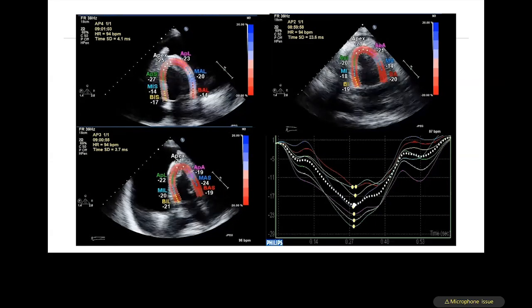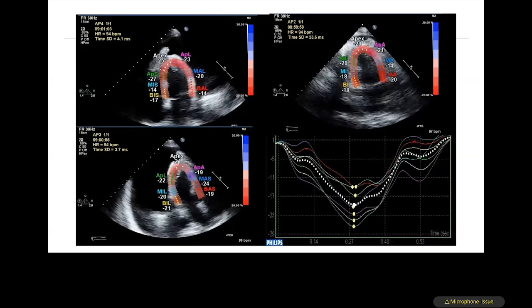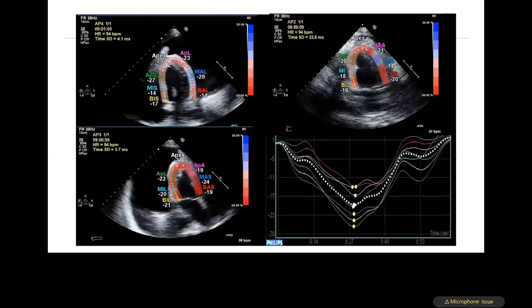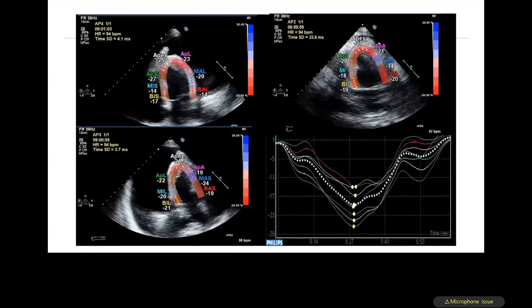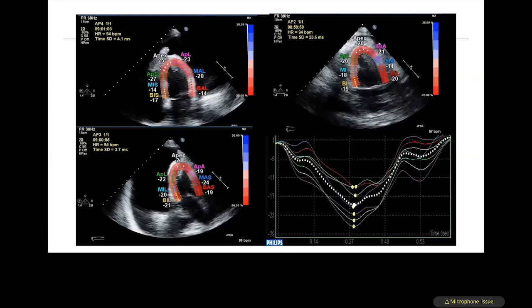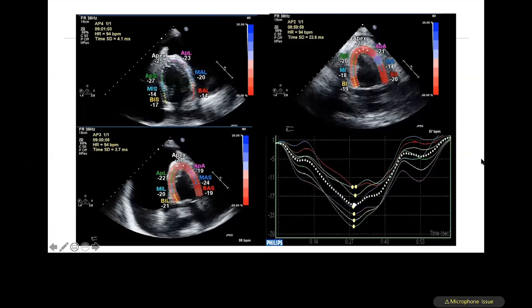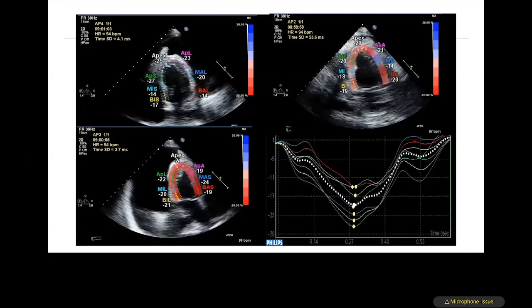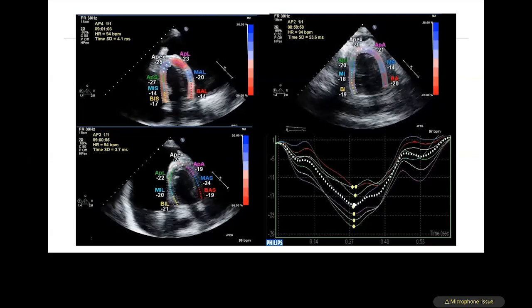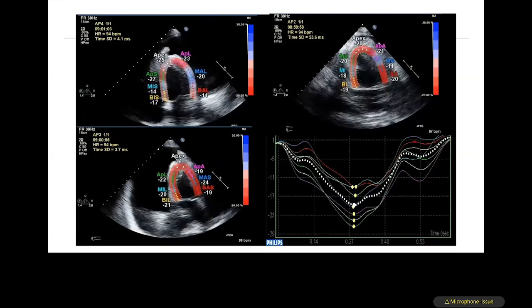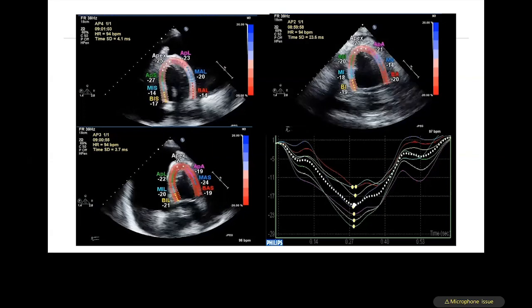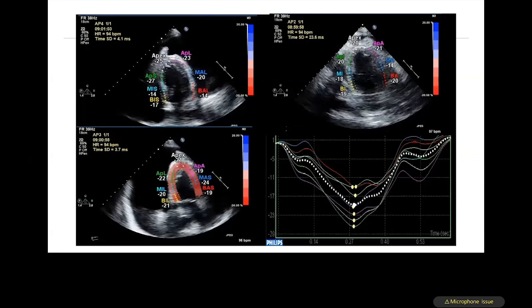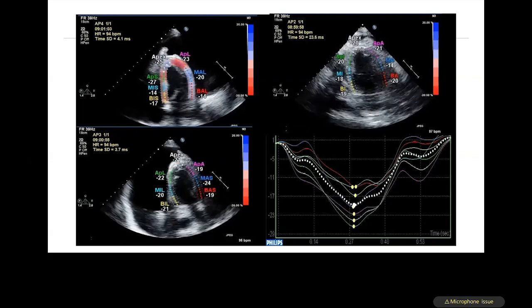Speckle tracking echocardiography showed preserved longitudinal deformation of the LV — a global longitudinal strain of approximately -17%, very close to -20%. The longitudinal strain being near normal in this heart failure patient indicates the myocardium is able to contract longitudinally, maintaining stroke volume, and helps eliminate myocardial disease as a cause of heart failure, consistent with constrictive pericarditis.